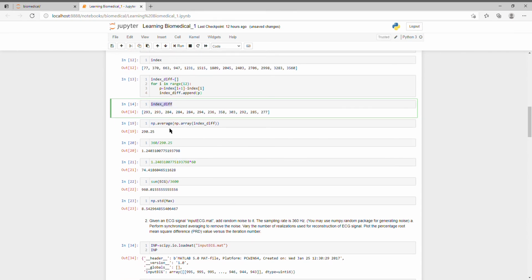So we'll just take the average of it, and we have got the average as 290.